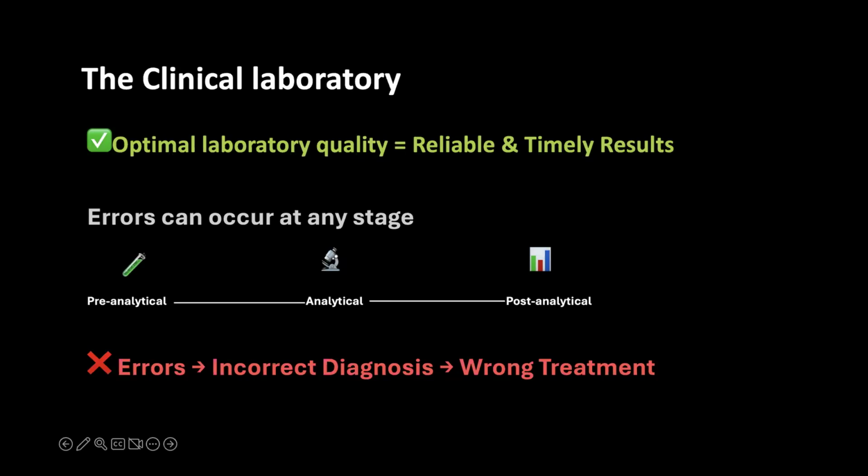So we use the International Organization for Standardization Standards, and according to that, the pre-analytical phase begins with the doctor's request, and it includes patient preparation and identification and collection of the specimen, as well as the transport of those specimens to and within the lab. This phase only ends when the analytical step begins. Next slide, please.